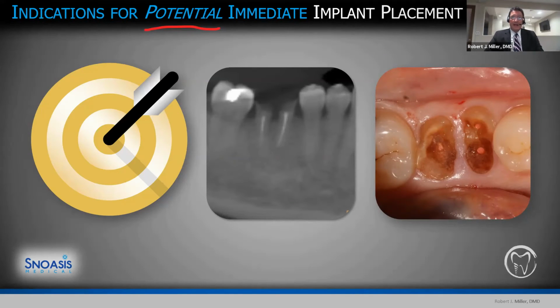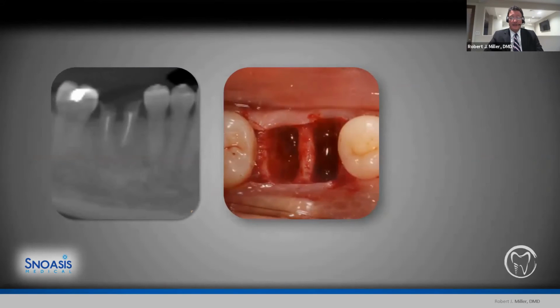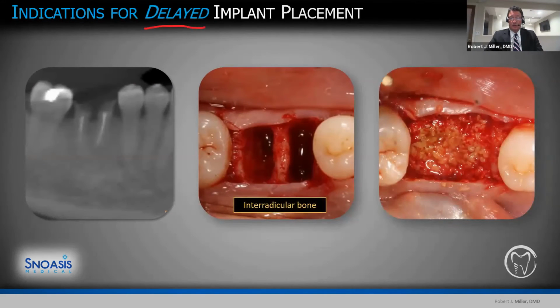And when most people think about prosthetically guided implant placement, a lot of the times they're thinking of anterior positioning, the buccolingual inclination, things like that. But it's also true in the posterior sextants, replacing molars and bicuspids. So here's the clinical, this is what the area looks like clinically. The next step is to remove those two residual roots. Yes, there's no question that I could probably figure out a way of getting an implant in there immediately. But again, it will not be prosthetically guided. It'll be surgically driven.